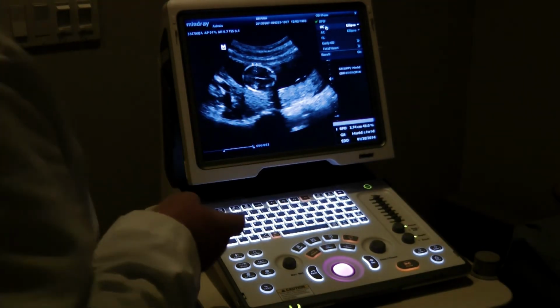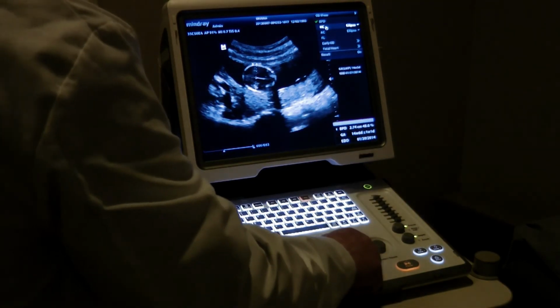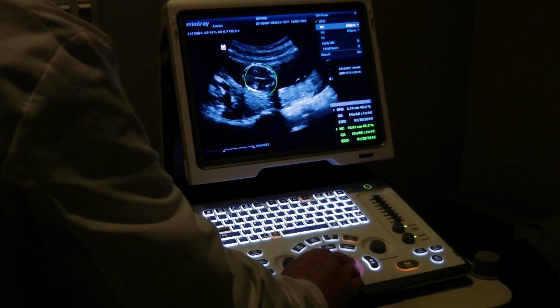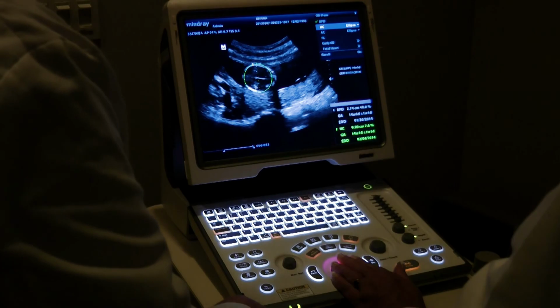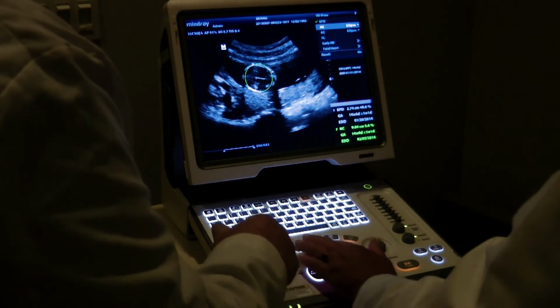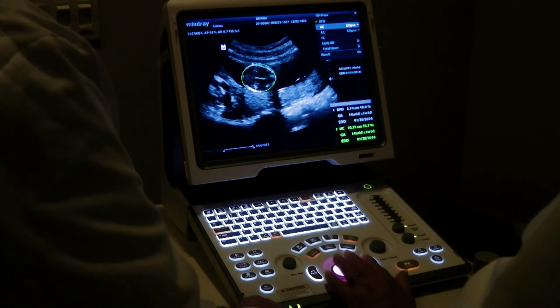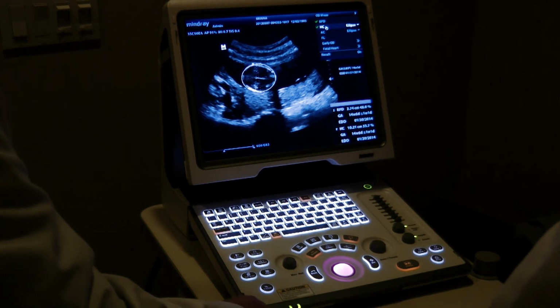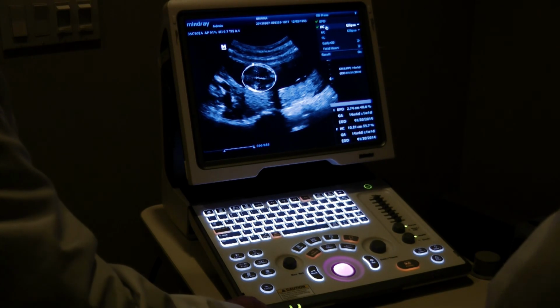Now we can also use the same image for our head circumference. Perfect. So we go, it's automatically jumped to the head circumference. We can hit that. Okay. And it'll start from that point that we had our BPD. Okay. So we set this like so. Go ahead and get that in the middle and set, and then you can hit change. We hit set. Update. We hit set. Yep, okay, and then we can rotate outside. Perfect. Alrighty, so now we got a head circumference that's correlating to our BPD. Really good. Right on.